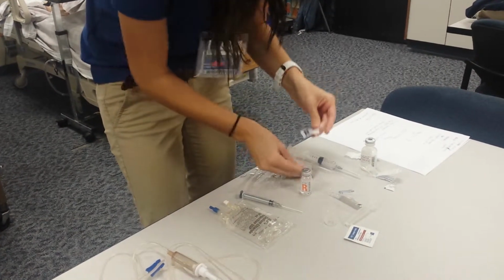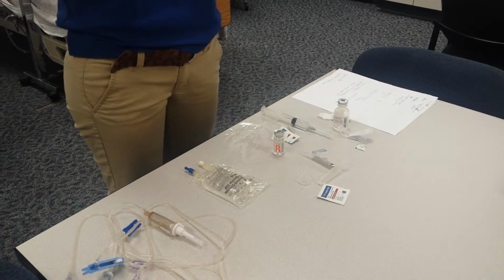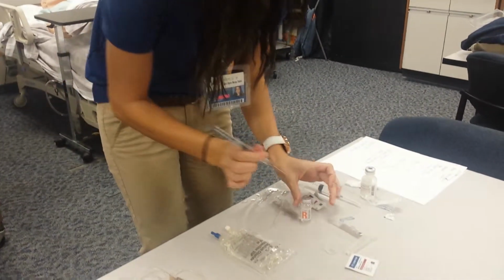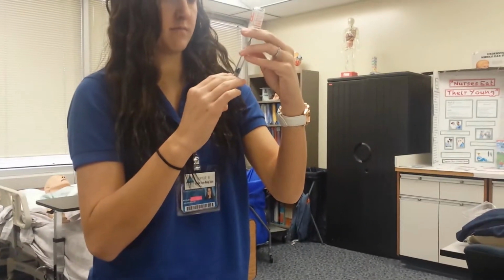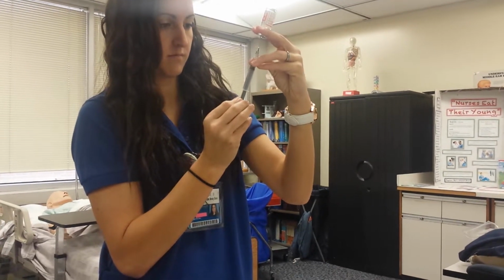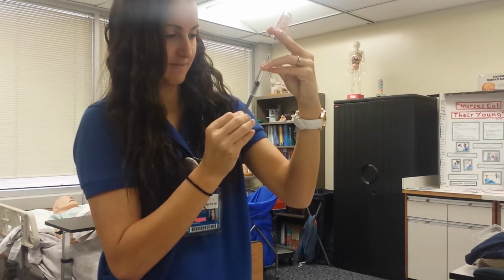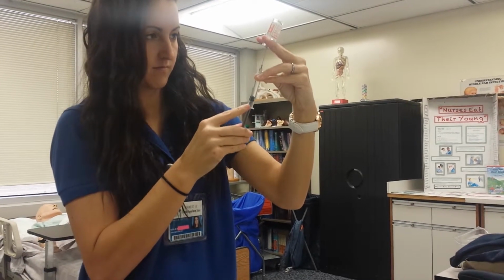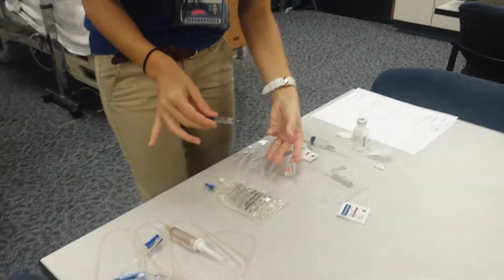Cleanse the top of this vial. 2.5 cc's of air. Have 2.5 cc's of vancomycin.